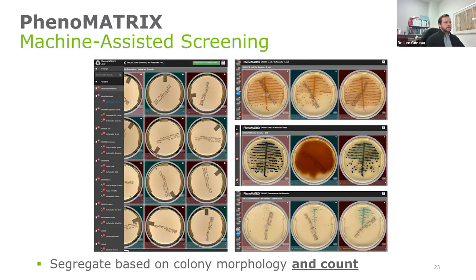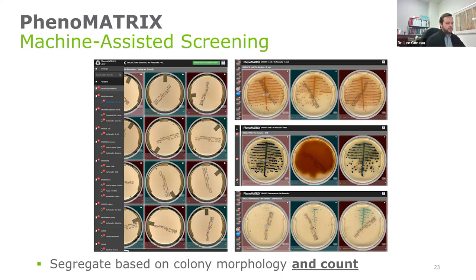This is an example of what Phenomatrix looks like — machine-assisted screening for urine culture. On the left-hand side of the screen, you see a lot of no-growth plates, and Phenomatrix has segregated these into a no-growth folder. On the right-hand side, you have examples of what positive plates might look like: significant growth of E. coli at the top (that pinkish colony), gram-negative bacilli in the middle, and enterococcus on the bottom right. Phenomatrix is doing that completely on its own. Once the specimen has been loaded, the technology handles everything up until this point — that's the first point of human intervention. Phenomatrix is basically doing what a person would be doing: segregating based on colony morphology, color, size, and colony count to determine if this is a significant or non-significant urinary tract infection.